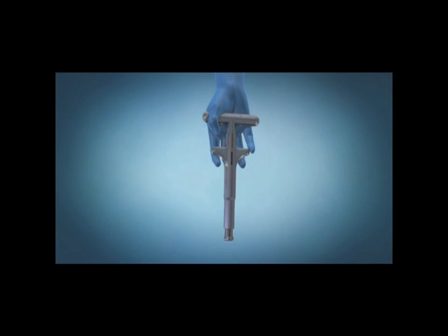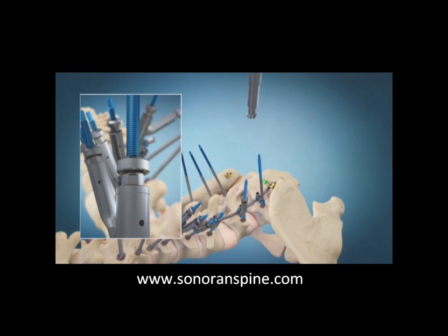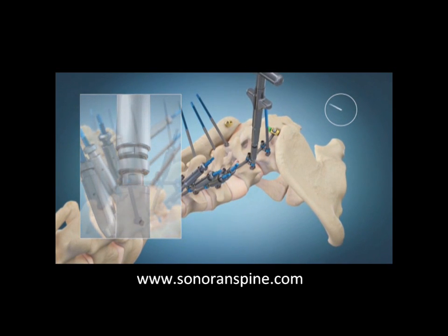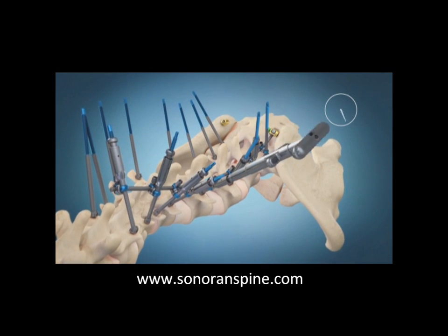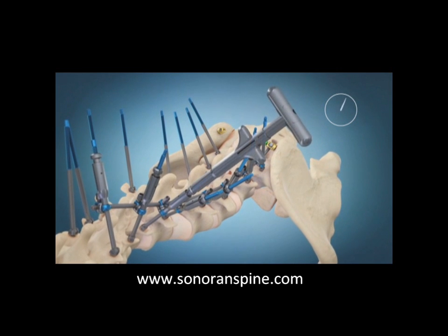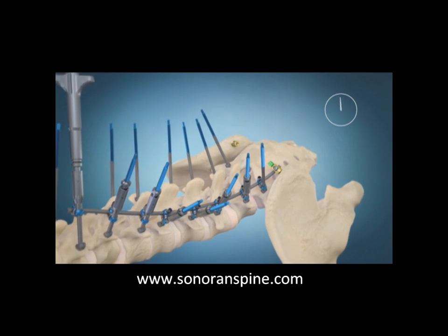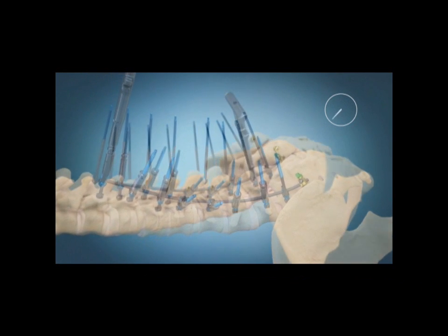This is how correction occurs. So you take this quick-threaded driver, squeezing the driver, sliding it past the threads on the post, and then releasing it and turning it. As it turns, it pulls that screw and consequently that vertebral body over to the rod. So you're literally pulling the spine to the rod, which corrects the spine in the coronal plane, or in other words, the scoliosis, but it also corrects the spine in the sagittal plane.